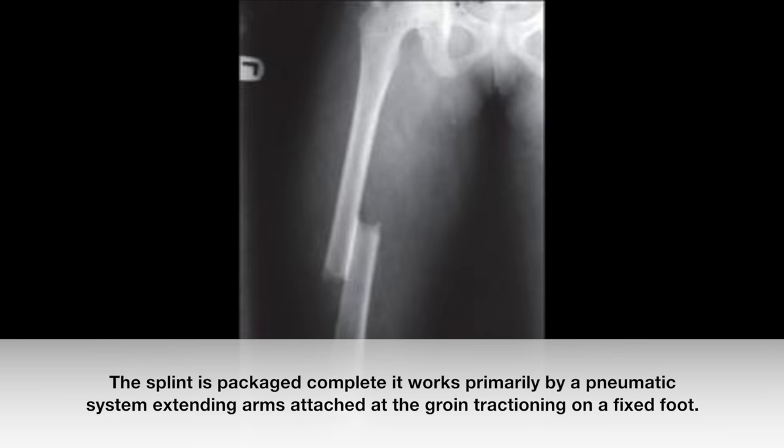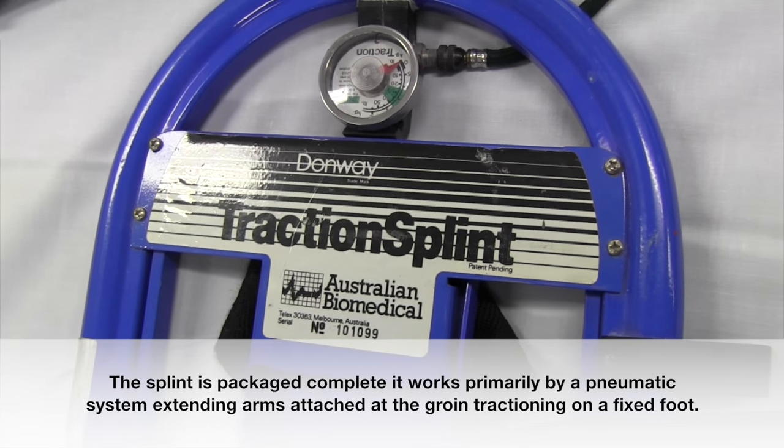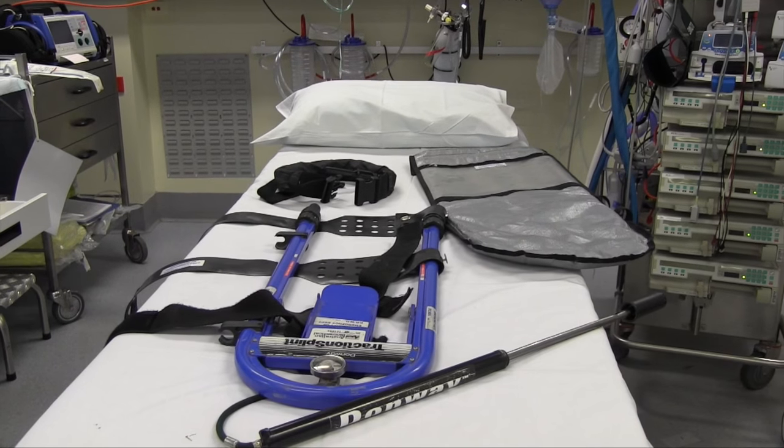Femoral fractures require initial treatment with traction. This gives stability to the fracture, reduces the bleeding and pain, and we demonstrate the Donway Traction Splint.